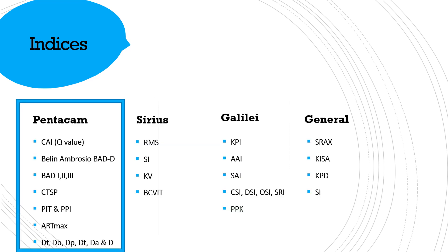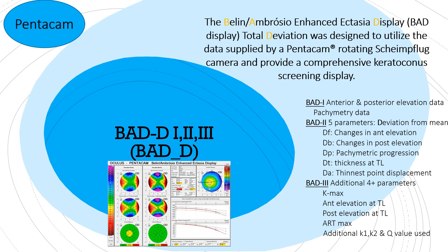We'll do the Pentacam indices one by one. Pentacam indices are displayed in a separate printout which looks like this, and it's called the BADD display — Belin-Ambrósio Enhanced Ectasia display, or BADD.